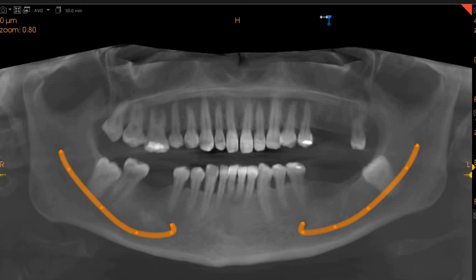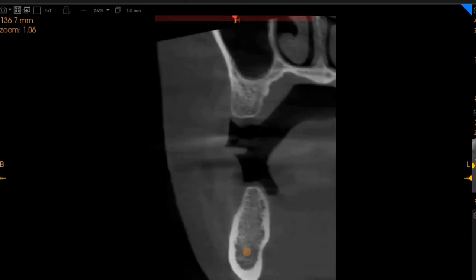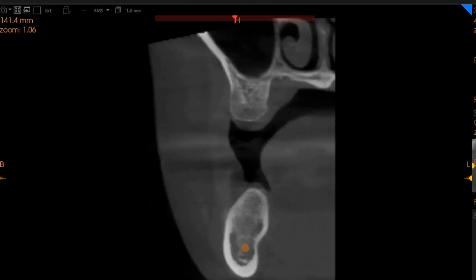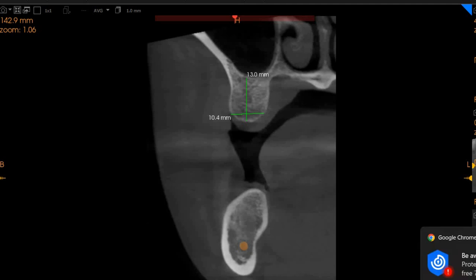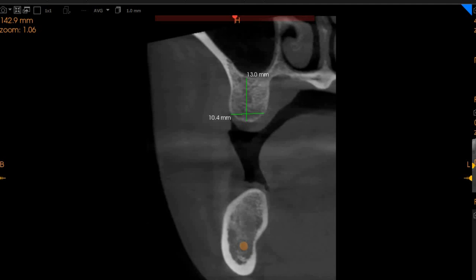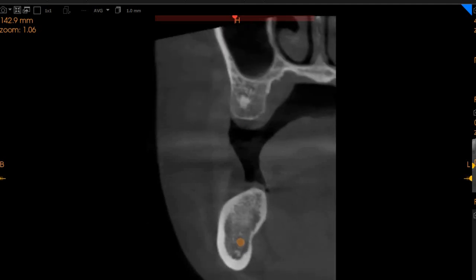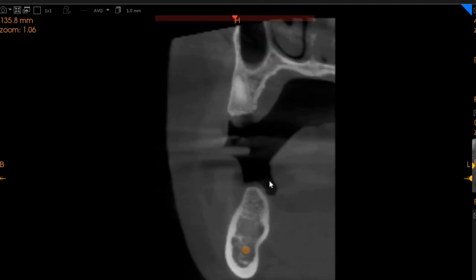Here you can very clearly see in the region of the six, and this is the transaxial view. We've got D3 quality bone, approximate ridge width is 8 millimeters of width and 10 millimeters of height — a good place for implant placement. In the region of the seven, we've got very good ridge with D3 quality bone, 10 millimeters of width and 13 millimeters of height — upper left segment.